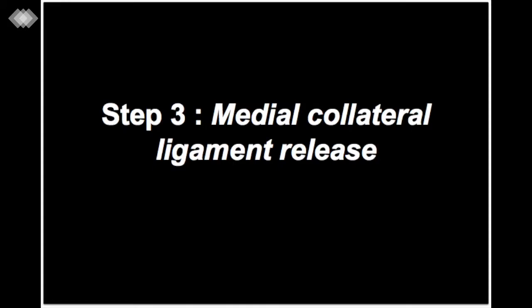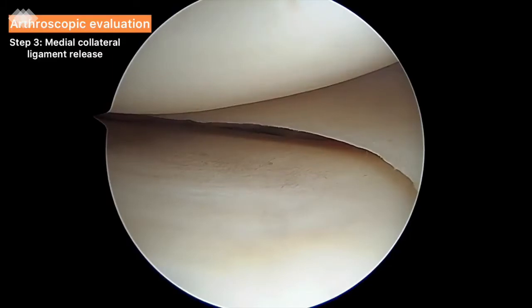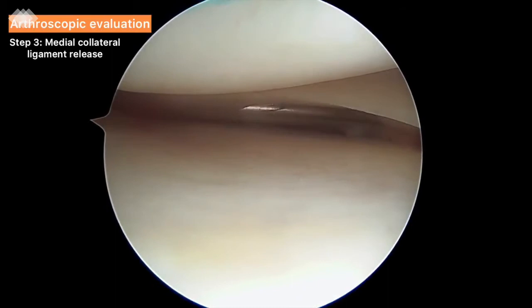Step 3: Medial collateral ligament release. We return to the anterior part of the knee to perform the medial collateral ligament release. We apply a valgus force with the knee flexed to 20 degrees to stretch the MCL fibers. We locate the medial joint line with an 18-gauge needle, which is introduced in the posterior third of the joint line under the medial meniscus.